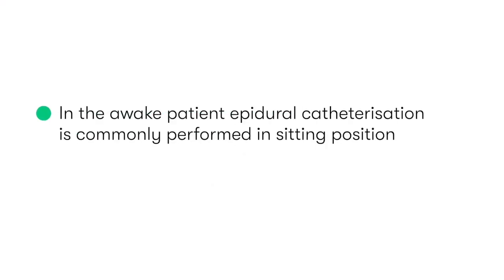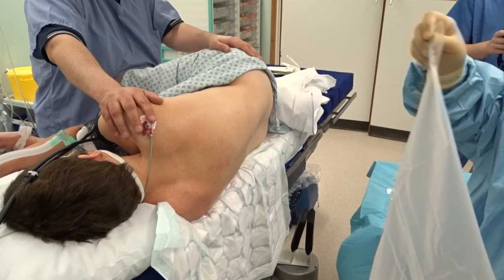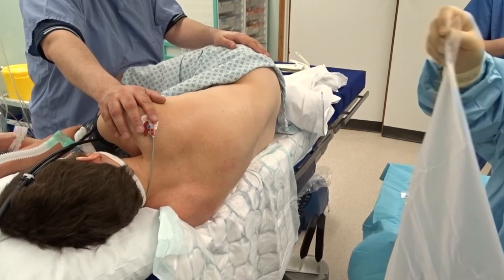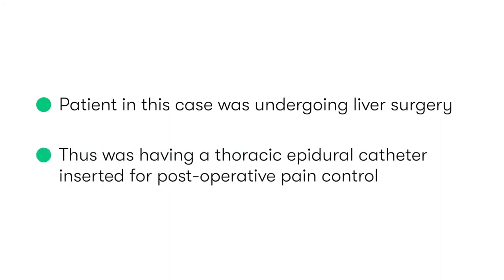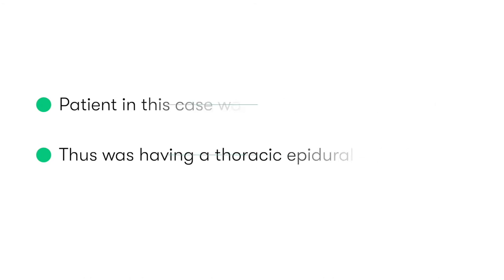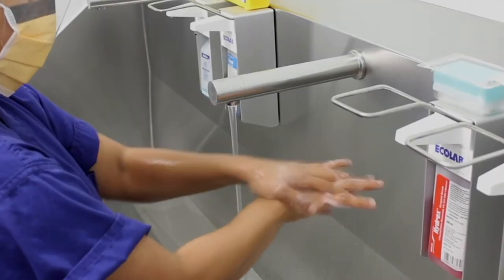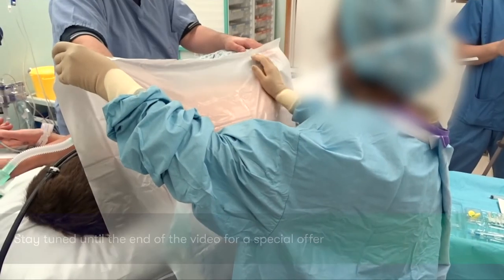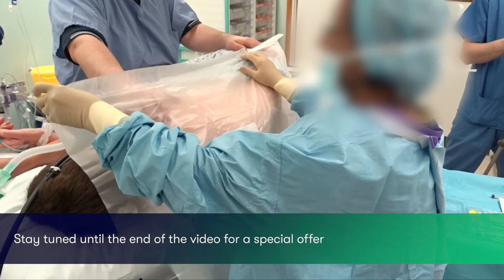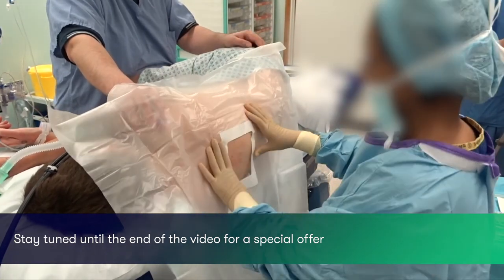In the awake patient, epidural catheterization is commonly performed with the patient in a sitting position. However, in the patient under general anesthetic, as is the case here, the lateral decubitus position is typically adopted. The patient in this case was undergoing liver surgery and thus was having a thoracic epidural catheter inserted for post-operative pain control. Having put on our surgical mask and cap, washed our hands, and put on our sterile gown and gloves, we clean the insertion site with antiseptic solution. We then place a sterile drape with a hole in the middle over the catheter insertion site, located at the lower thoracic vertebral column.